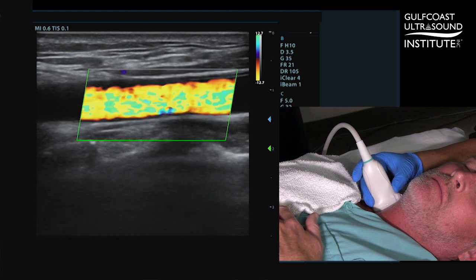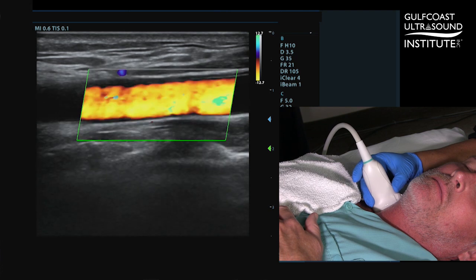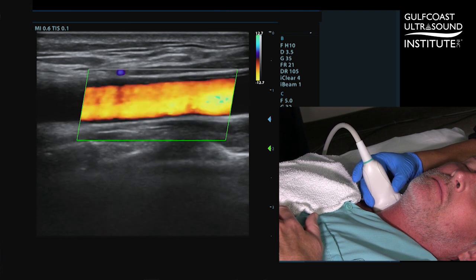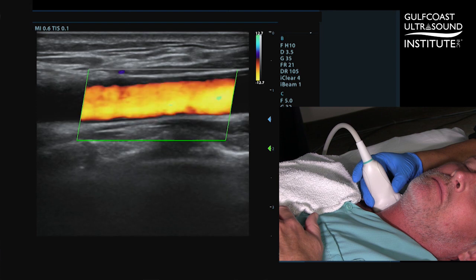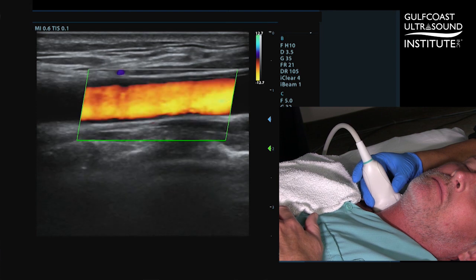If the vertebral artery were blue while flow in the CCA and the bulb were red, this would indicate retrograde flow and would suggest a subclavian steal.